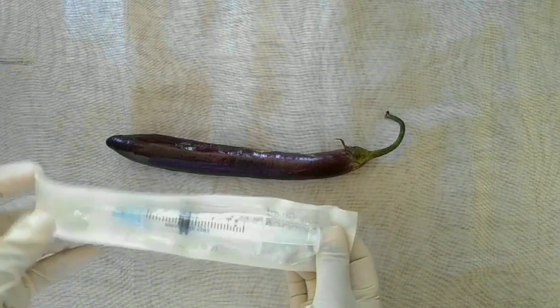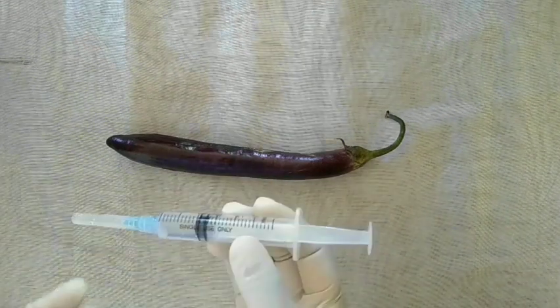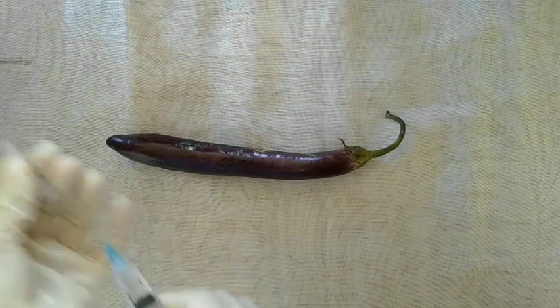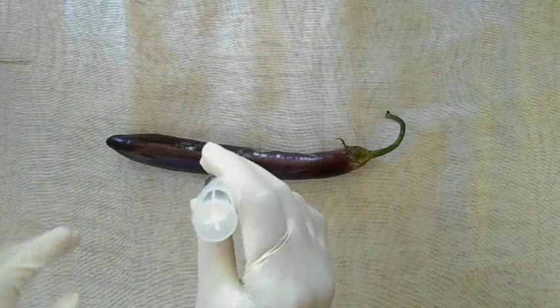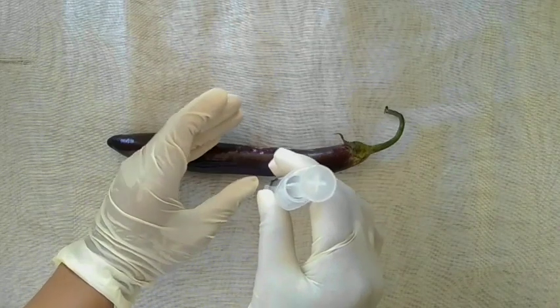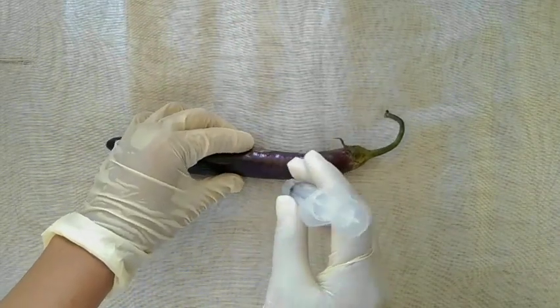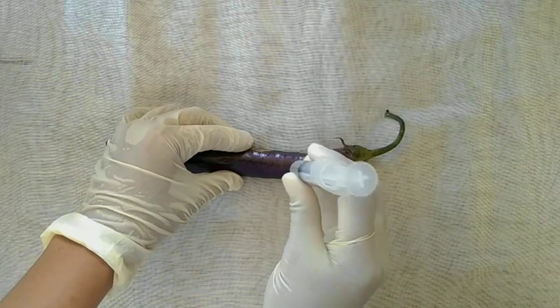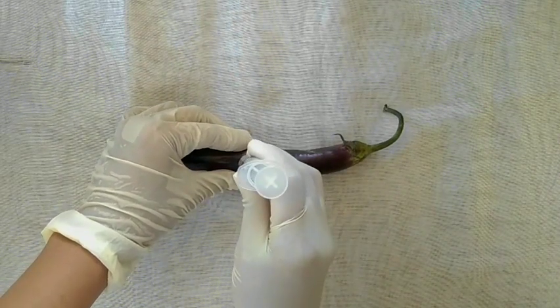So we are going to get our syringe. Now uncap the syringe and hold the syringe as if you were holding a dart. Then slightly pull the skin. And inject the needle into the patient's skin at a 90-degree angle. Slowly.